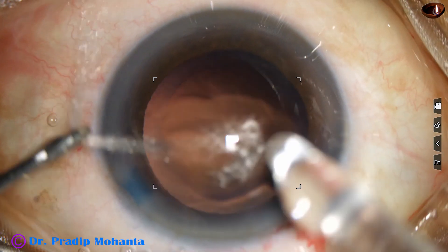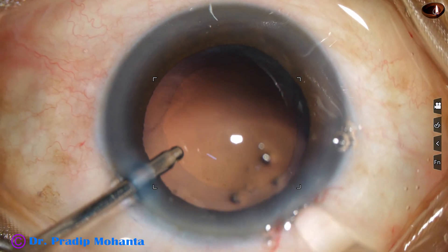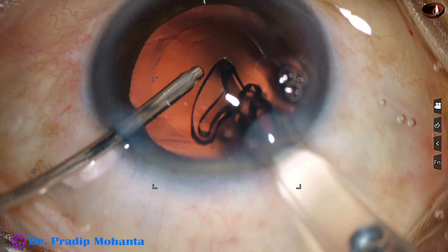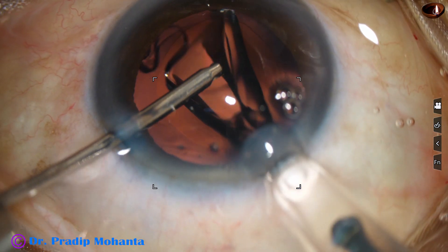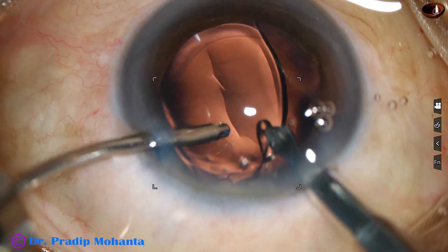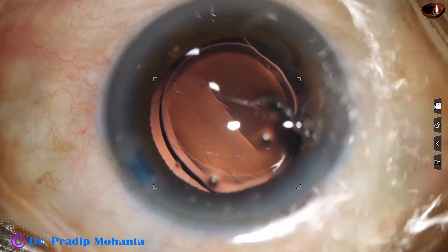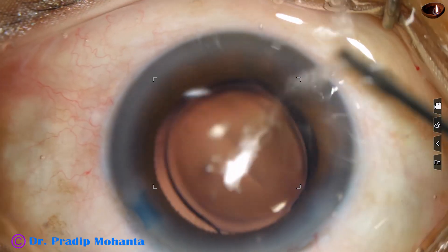And now is hydro-implantation of a single-piece monofocal intraocular lens. The leading haptic goes into the capsular bag, and just by a push of the left-hand instrument, the trailing haptic also goes into the capsular bag.